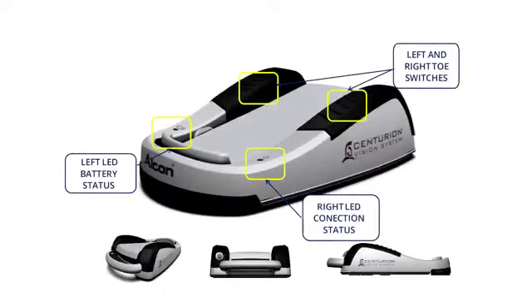The range of each of the 4 settings is not equal. It's adjustable. In addition, foot pedal settings might be fixed or linear. Fixed is on or off. Linear builds via excursion of the foot switch until the programmed maximum preset value is reached. It's best to discuss your foot pedal settings with your company representative.